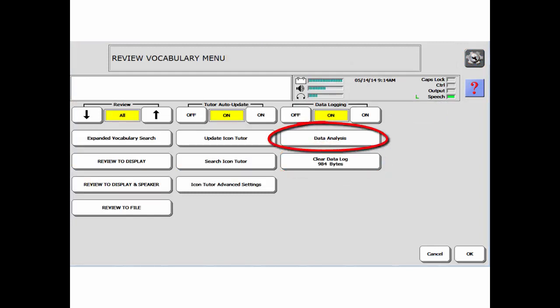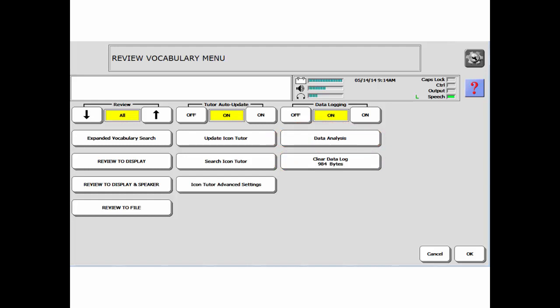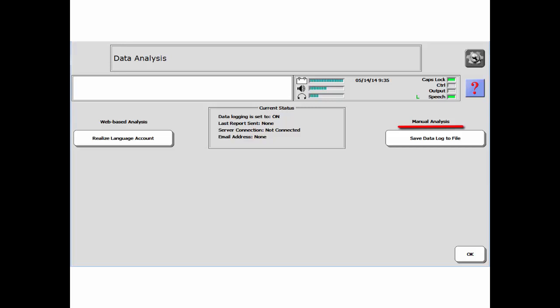Select Data Analysis. To the left, you see an option for Web-based Analysis. To the right, Manual. For more information on automatically uploading your data to Realize Language via Wi-Fi, please watch that video in this playlist.